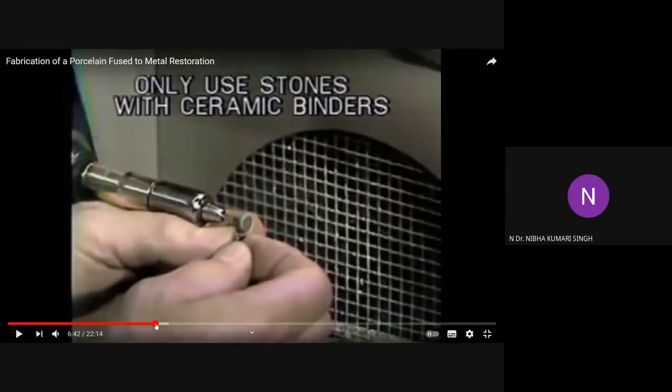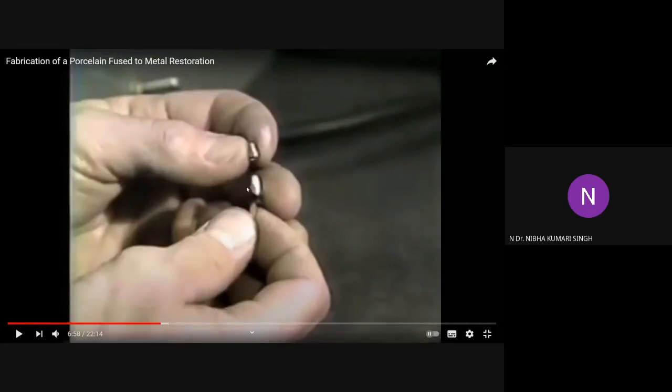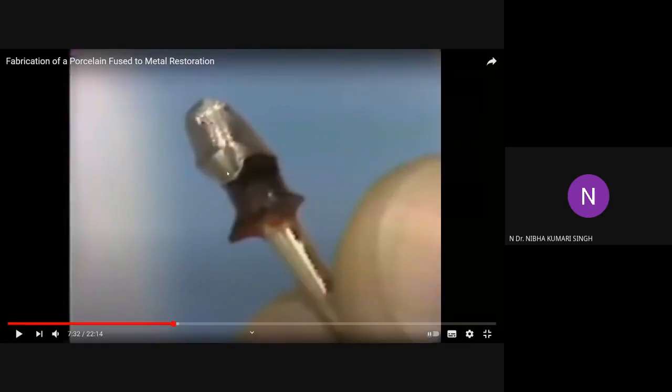You know all this investing and burnout procedure. You know that the metal crown is fabricated by any of the methods, either casting, electro deposition, swaging, or CAD CAM procedure. After the metal crown is produced, they are checking the width of the coping. The metal coping should have a minimum width of 0.3 mm. It should not be less than that, because if it is less than that, it is going to bend. Okay, so the metal crown is fabricated by the traditional casting procedure.